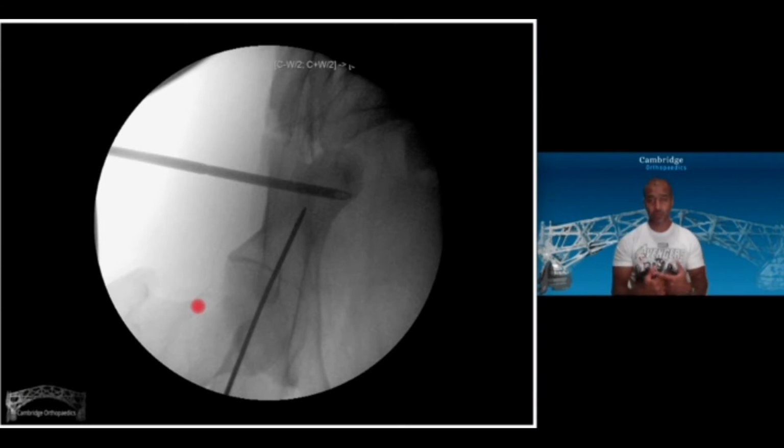So my strategy here was to put a shank pin in the crest, so come back pelvic model. So if we're looking here, what's the best way to describe that? Here, I'm putting a shank pin in the crest just distal to where the fracture line is. Okay, I'm parking up a guide wire which goes from the AIIS, aiming along this column of bone to the PSIS, making sure it's safe on my iliac oblique view. And get it parked up. That guide wire is parked up. It may not be perfect, but you want some stability to return.